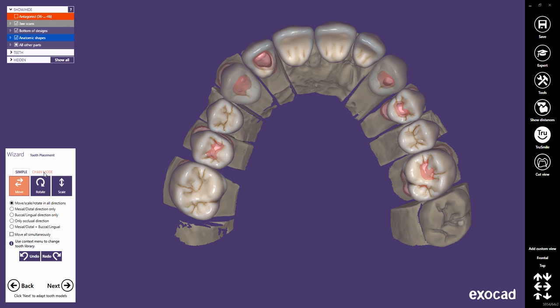This quick guide tutorial from ExoCAD shows the Chain Mode tooth placement feature. With ExoCAD DentalCAD version 2016, the Chain Mode feature is available in the Tooth Placement dialog, which appears in the wizard right after the Crown Bottoms dialog.